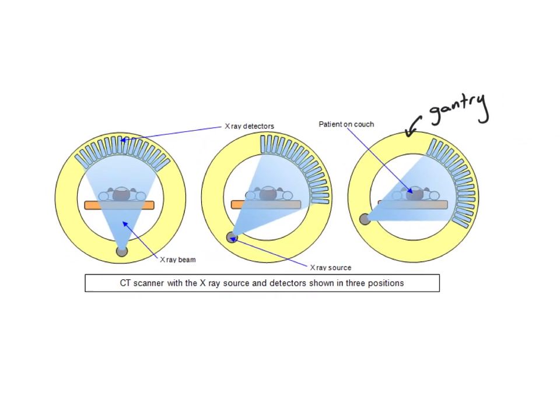Okay, so exactly how does this work? We have, inside the gantry, so this is the gantry that's labeled here, a person who will lie on a table that is movable in and out, and you definitely will have an X-ray tube on one side of the gantry. So this will be your X-ray tube here, and all of these are an array of detectors on the opposite side, so they can pick up the X-rays.